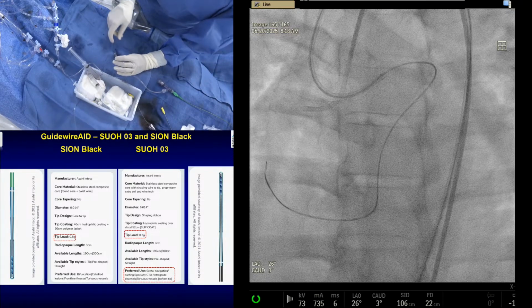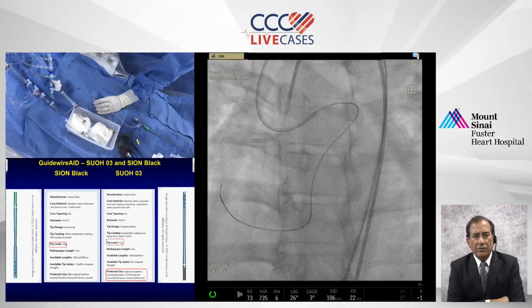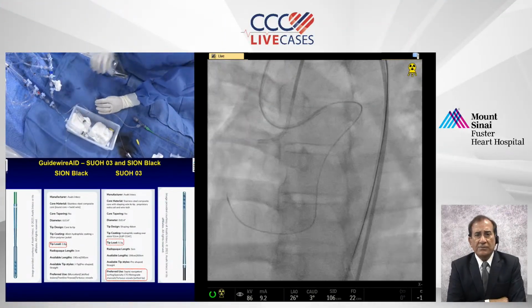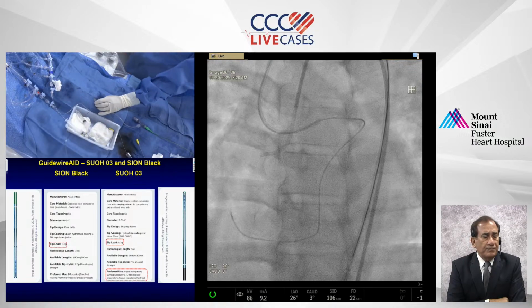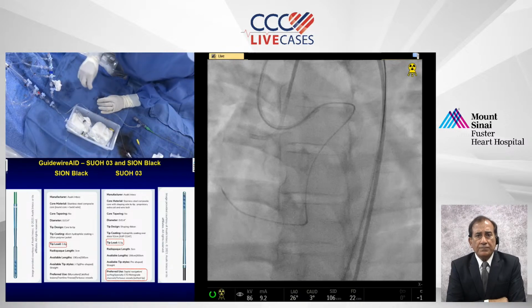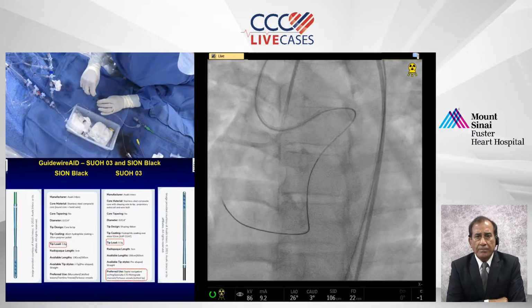As soon as I look at where this shield is, it's completely protecting me. Not only that, both Samin and you very intelligently use collimation. Only I use collimation. But ours is the single view. We will do the whole case with a single view, and that's it.